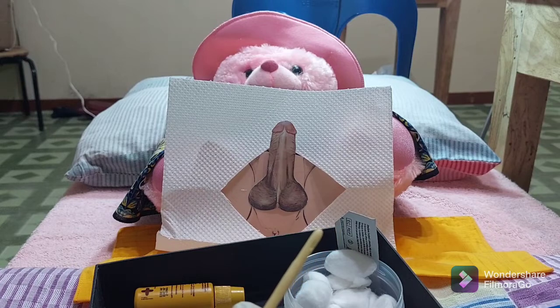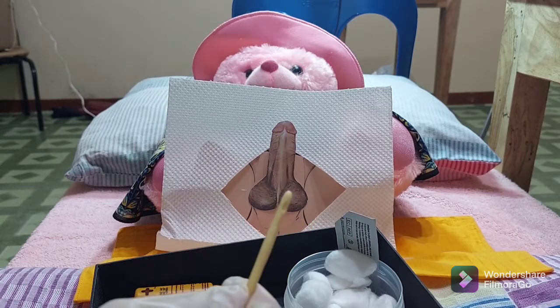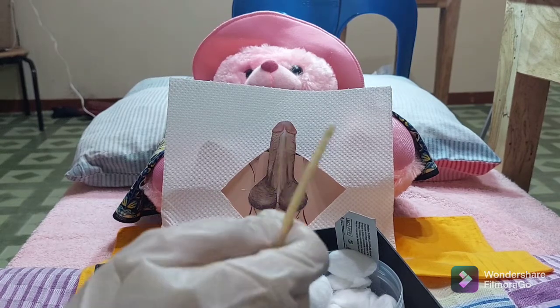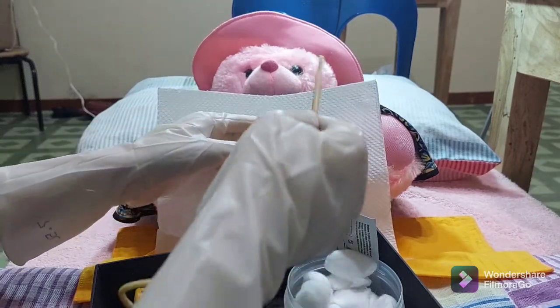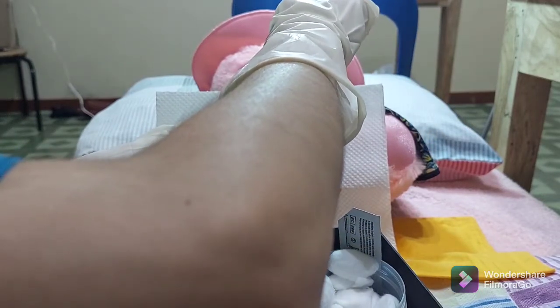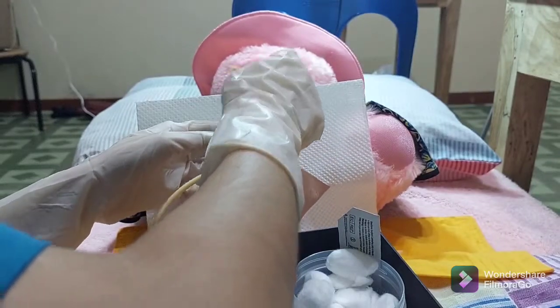In male patients, hold the penis perpendicular to the body and pull up slightly on the shaft. Ask the patient to bear down gently and slowly insert the catheter through the urethral meatus. Advance the catheter 17 to 22.5 centimeters or until urine flows from the catheter. This process helps visualize the urethral meatus and relax the external urinary sphincter.